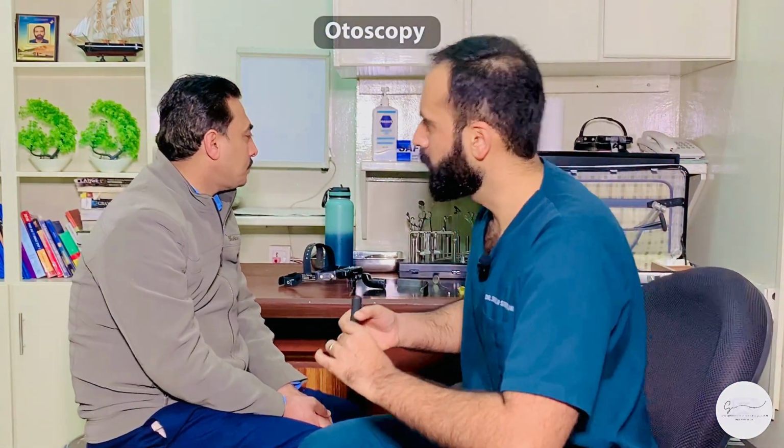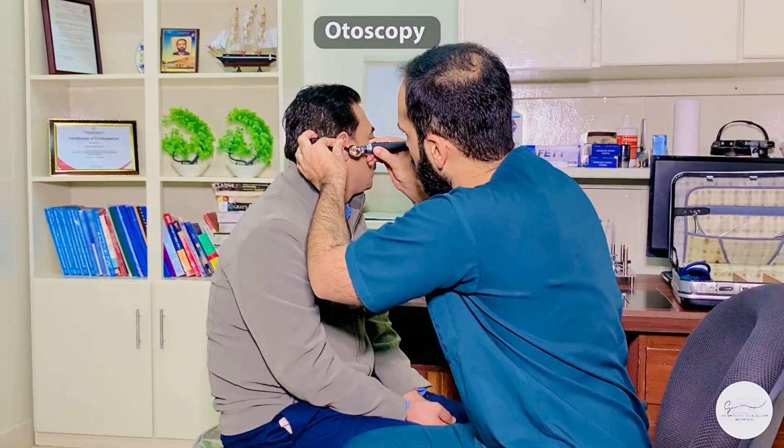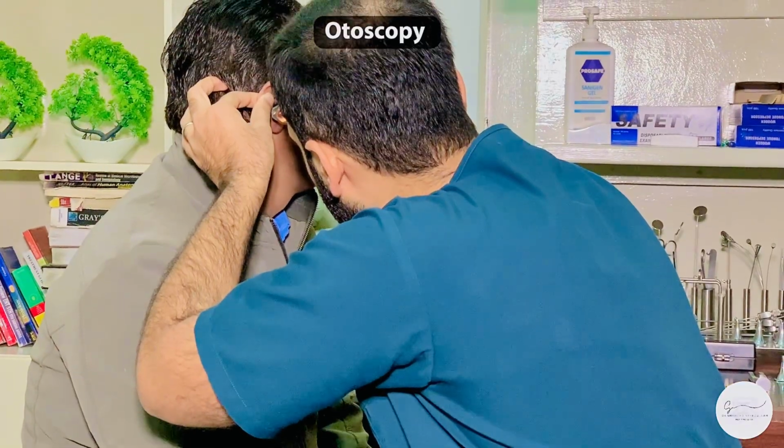After examination with the speculum comes otoscopy. We take an otoscope. I always see my students struggling on holding an otoscope. Sometimes they are holding it like this, sometimes they are holding it like this. The correct way of holding it is you hold it like a pen, the same way that you hold a pen. You turn the light on, check whether the light is good enough for you to be able to see inside. You pull the pinna upward and backward and gently introduce it. And then you have a look inside at the tympanic membrane.